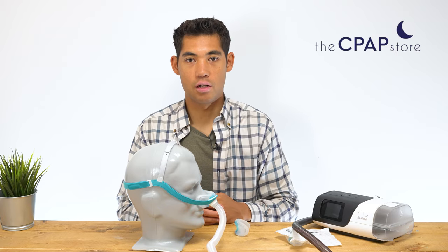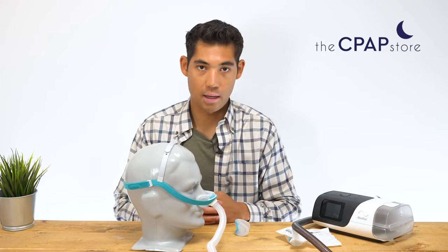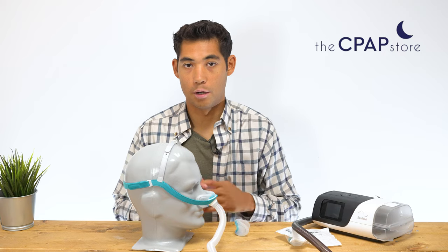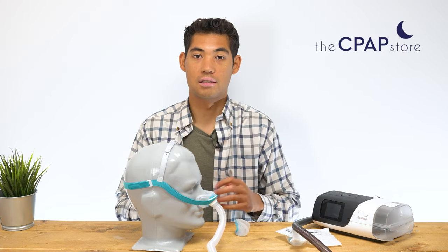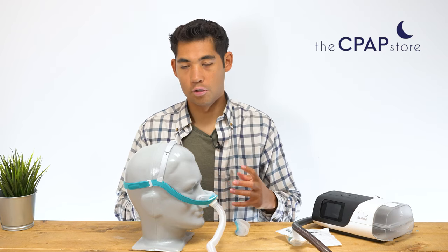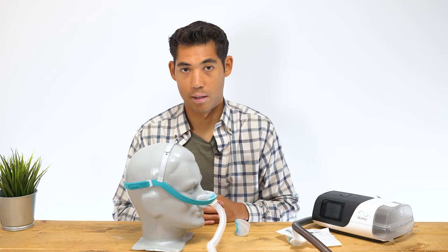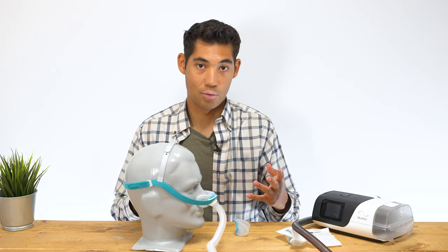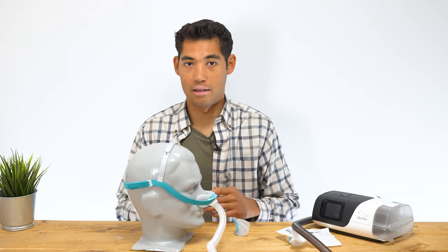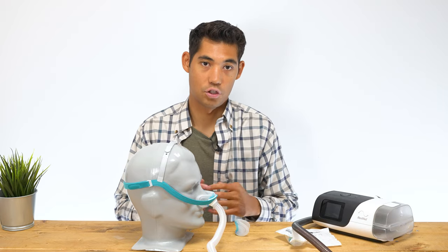Hi, my name is Tristan from cpapstore.ca. Today we're looking at the Fisher & Paykel Evora nasal mask. It's a very interesting design with definite pros and cons. Before I get into this review, please consider liking this video or subscribing to our YouTube channel, which is based around reviewing every single SKU on our CPAP website — pretty much every CPAP product. So if you want a video database on anything you might want to buy for your CPAP therapy, definitely check out our YouTube channel.